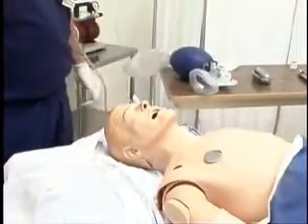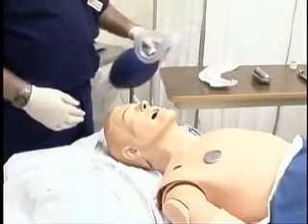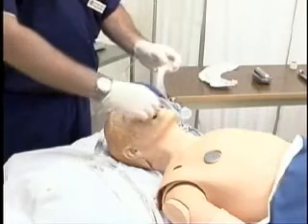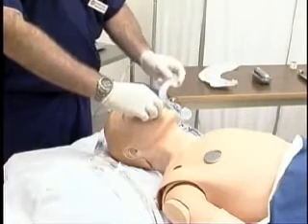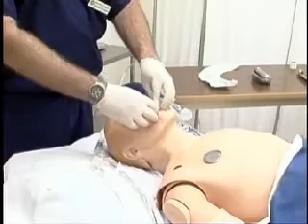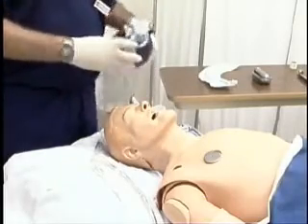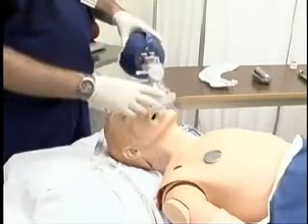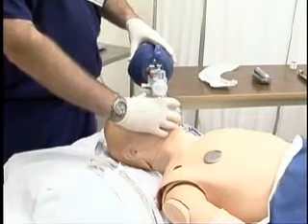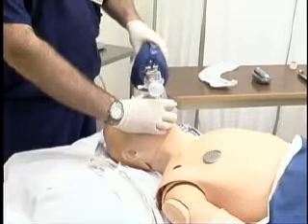We're now preparing to orally intubate the mannequin head here. The first thing we're going to do is pre-oxygenate the patient. We're going to place an oral airway into the mouth before we do that. You take your fingers and sweep the lips out of the way and place the oral airway in sideways. Once you get it all the way in, turn it upright and it falls right into place. We're going to put our manual resuscitator bag with the mask on the patient's face, make a seal — make a C with our hand, put two fingers under the chin and give a little tilt — and begin to ventilate the patient.